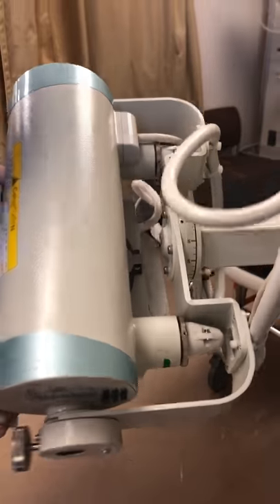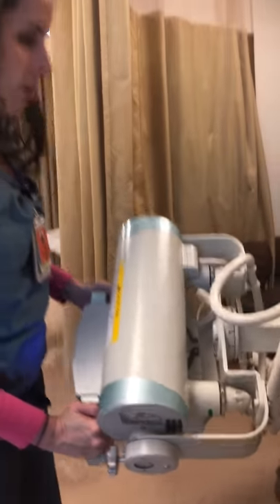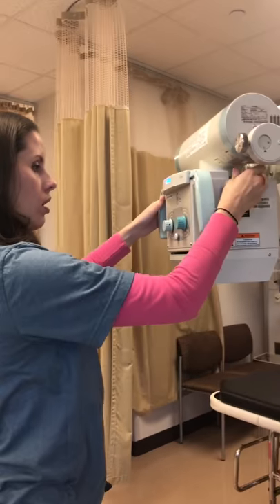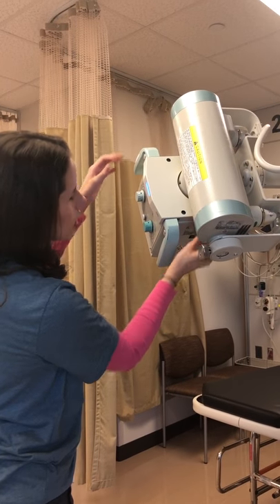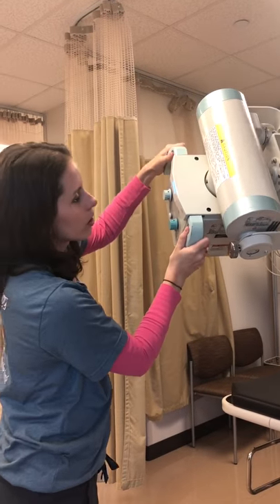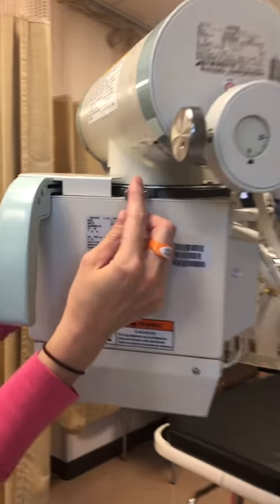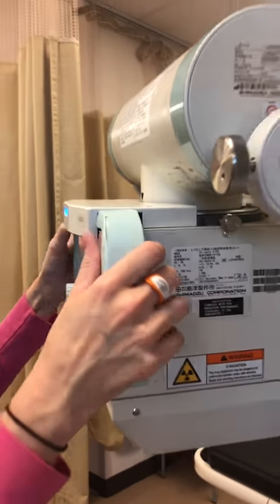This is actually the tube — the whole tube angulation itself. If you are taking an X-ray and you turn this and notice that it's just falling and not really staying, there are little screws right here that will actually tighten this up.